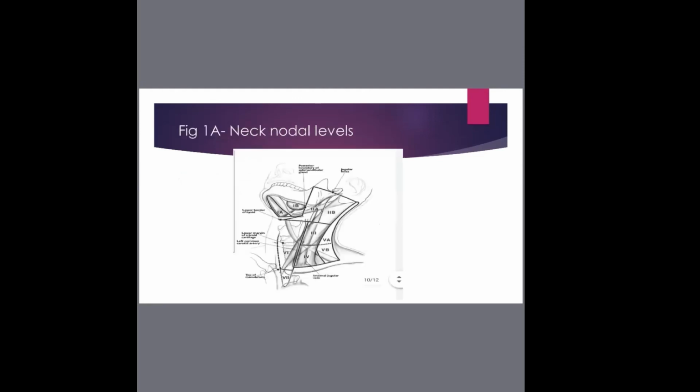And for some lymph nodes, we don't do FNA, because if lymph nodes are necrotic, even if you put a needle in there, you're not going to get any good tissue because they are all necrosed. So in that case, we do a core biopsy, which is taking a chunk of tissue. A bigger needle goes in there, pull it out, not the lymph node, you just take out some tissue chunk and send it to cytology, who will now decide what it is or the cause.